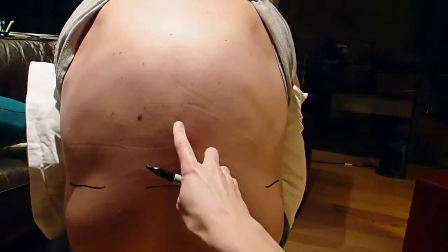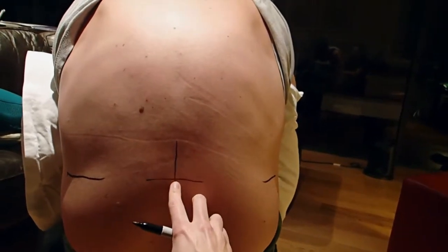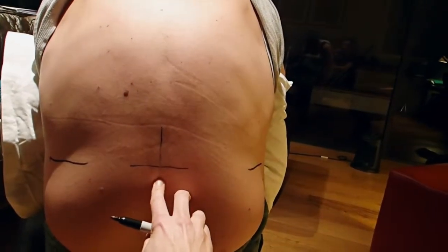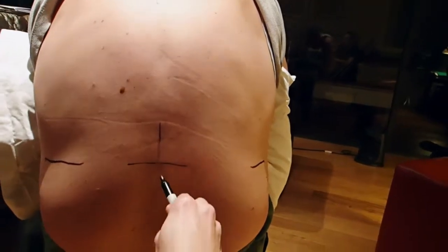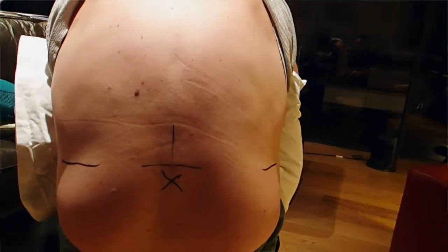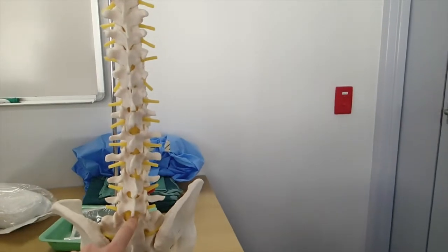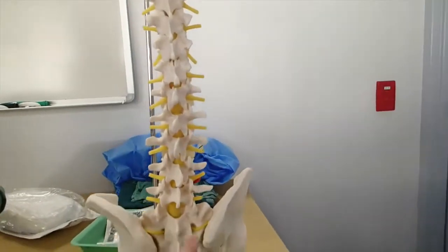So if I go, this is the midline here, beneath where the iliac crests are, and I feel that there's spinous processes poking out, and right there's a gap between the spinous processes. X marks the spot where I'm going to do my spinal anaesthetic. And then we go along to the space beneath that, and you can see the spinal cord should have ended by that point.